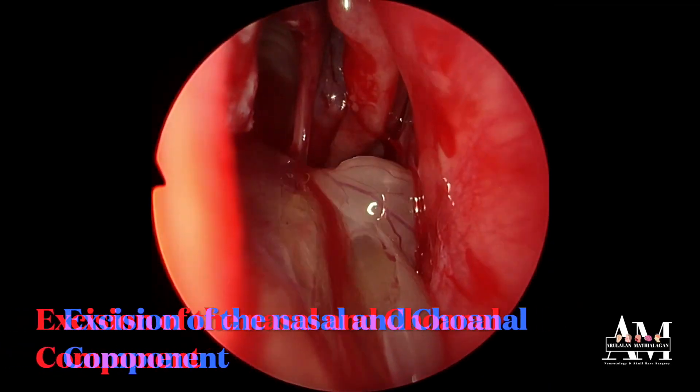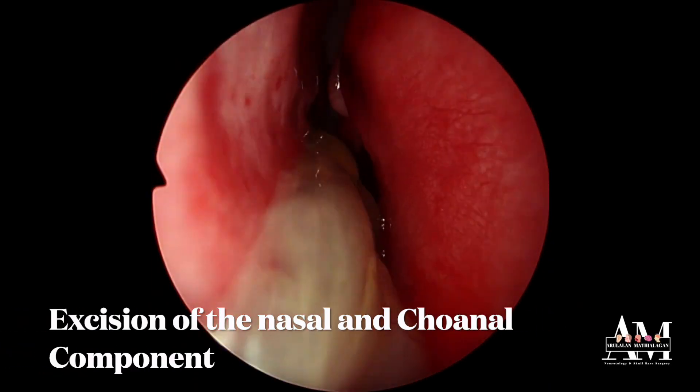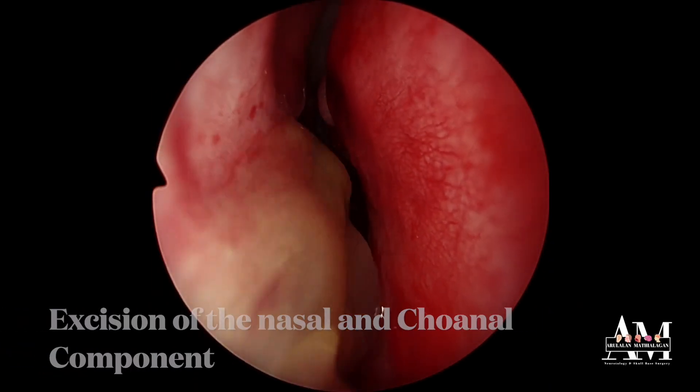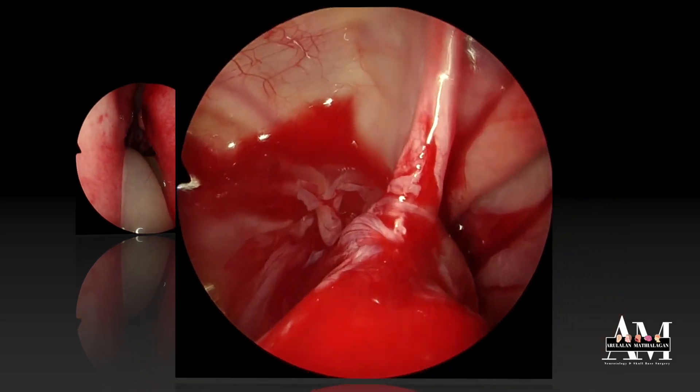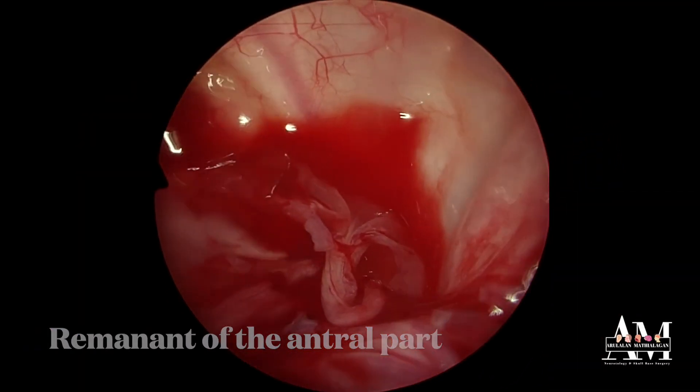Now the polyp is sectioned at the level of the nasal part, and the nasal and the choanal parts are excised. The antral part is left behind inside the maxillary antrum.